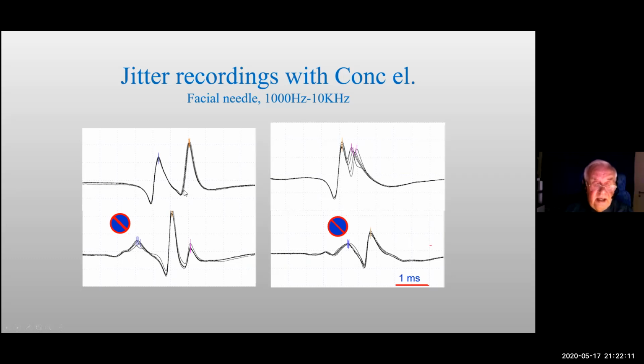And I see that since these lines are parallel, and I will say that a few times this afternoon, that we look that these signals are parallel. Here is a riding signal, but they are parallel. So you see the peaks have been measured, these markers. So this is okay. Here we're triggering on the second, and if we trigger on that, it's stable on the screen, and we have the jittering part here and the jittering part here.